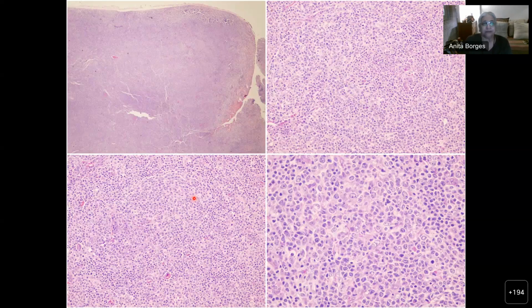And here you see a lymph node. It looks a bit diffuse. This is a very low power view. When you come to a little higher power, you begin to say, yeah, there are a few sort of follicles, but again, mantles are not well developed. You're seeing something that looks like a mantle, but this is all small. These areas are small. You can see some reaction centers, but here is a lesion.